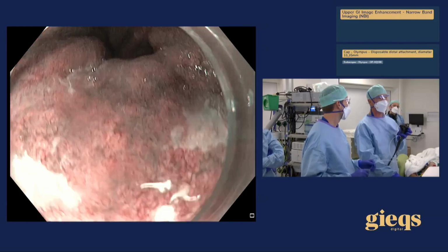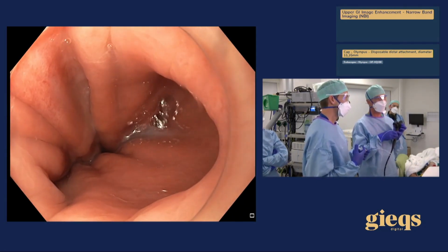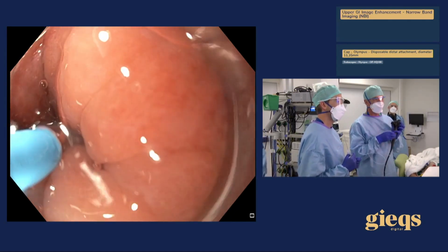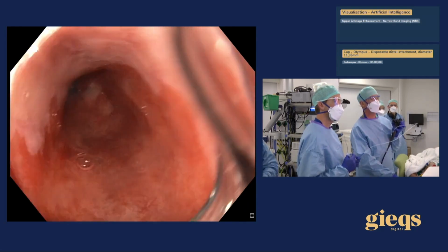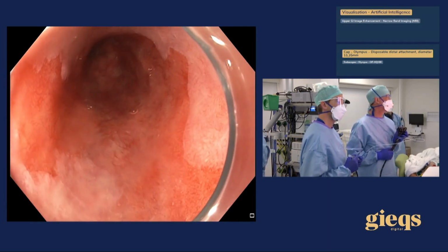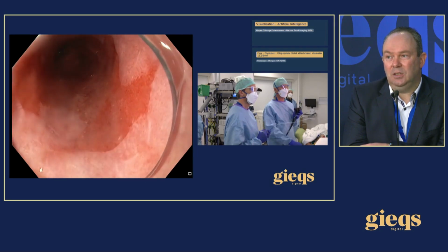Professor Bisschops, I have a question. Do you think there is a role for artificial intelligence in this setting? Yeah, I've been participating in a consortium in Holland, and they've done some nice work. It's still in its infancy. It was validated, presented at the Dutch Society, and probably they have an abstract also at UEG this week, where they take pictures, and these pictures can then be analyzed on site with the computer, indicating whether it's normal or not. But the real live detection is still preliminary.